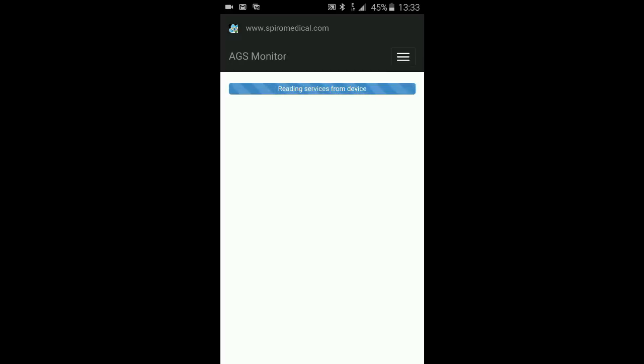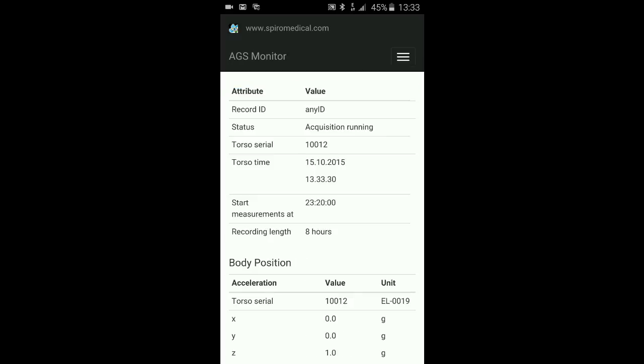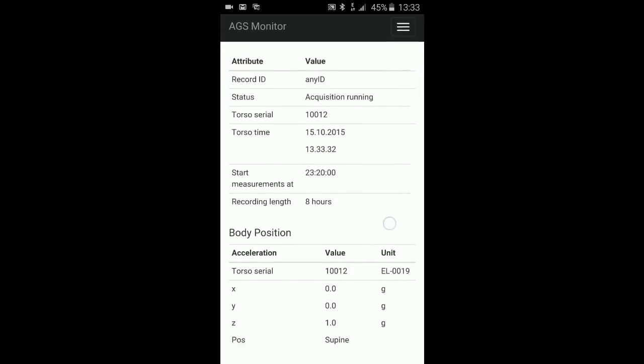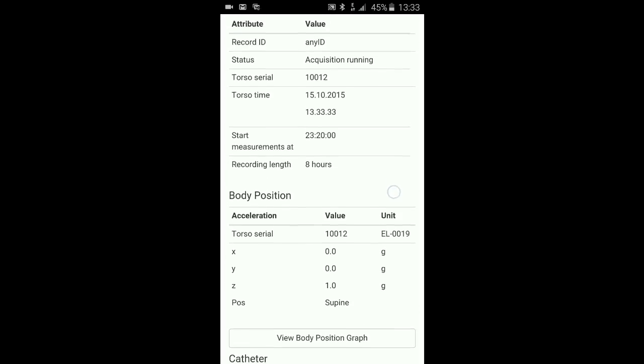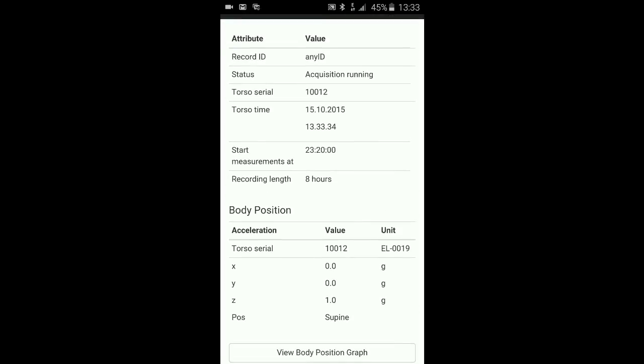It's reading the services and you now see the status of the unit. Recording ID is any ID. Acquisition is running. The serial number is 10012 and the time is displayed as well.